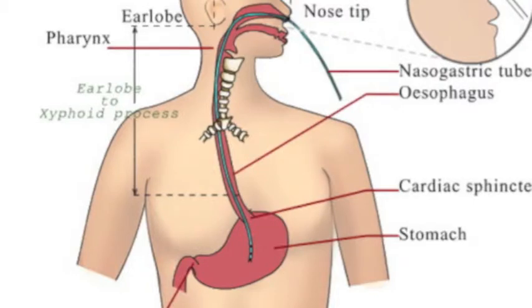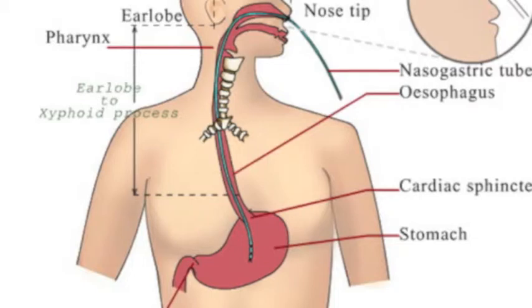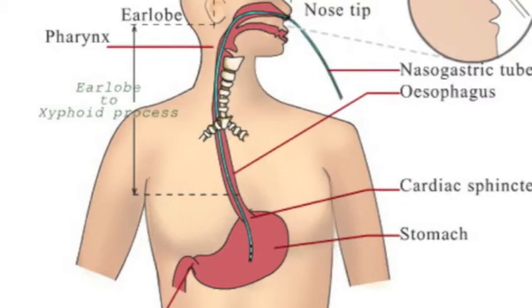This is out of the body. You get about 10 cc's of air, 10 to 30, in a large syringe. You displace the air down into the tube. You listen at the stomach, and you'll hear it. That's what Casabran uses. We do not do an x-ray after every insertion of a tube. We do the air, and we don't have point of care, so we don't do the acidity. So that is the inexpensive way of verifying. A lot of books tell us not to do that anymore.